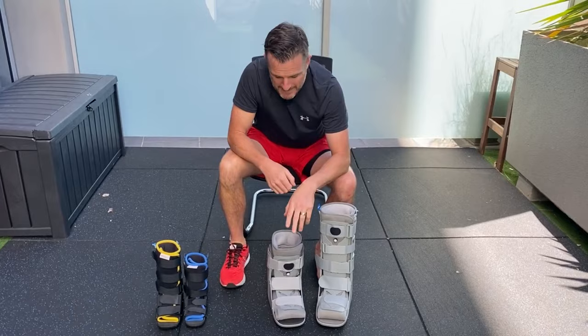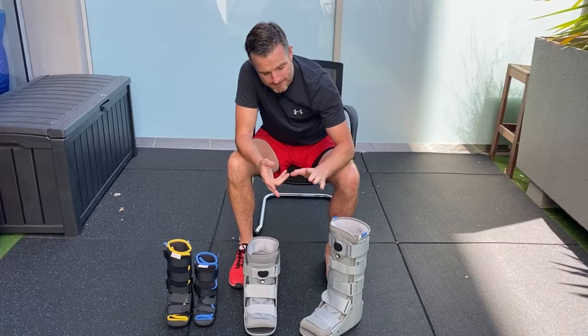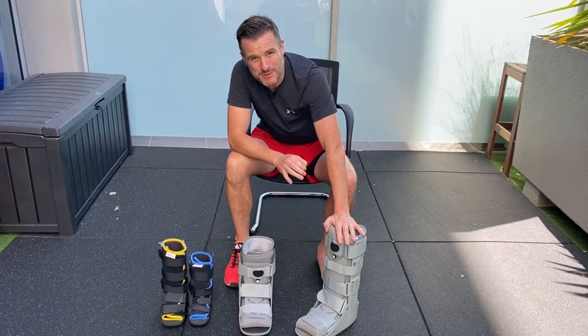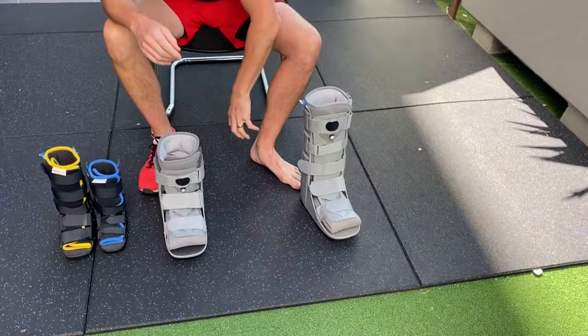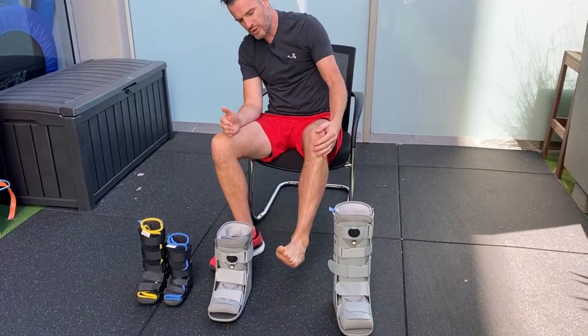For adults, walker boots with an air pump are the way to go. There are two types. If you've got an achilles rupture or repair, an ankle fracture, a bad ankle sprain, or ankle surgery, you're going to be in a tall walker boot. Anything from the ankle upwards requires a tall boot, because the height locks up the ankle and stops ankle movement.